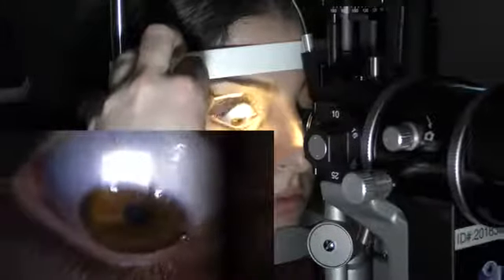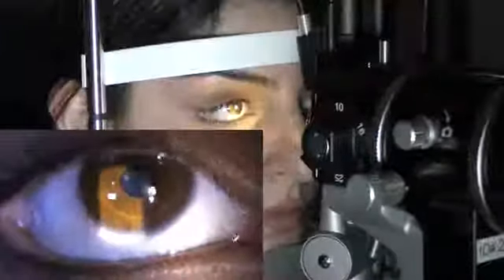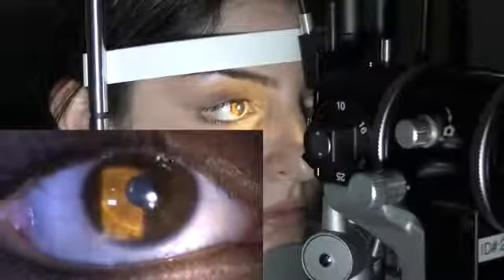Look down, please. And again, I'm going to pull the eyelids just gently upwards. And we're going to look to see how the conjunctiva looks, okay? Everything looks very healthy here. Now look straight ahead. Beautiful. Okay, next we're going to basically look at the cornea.